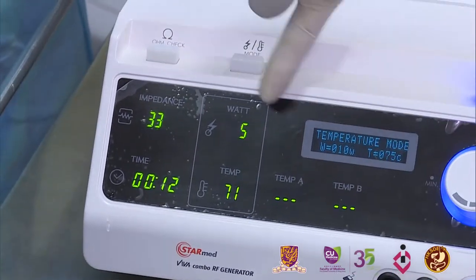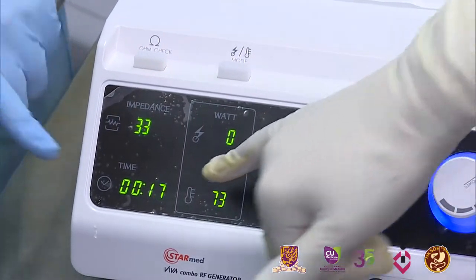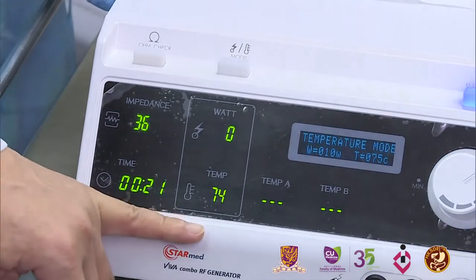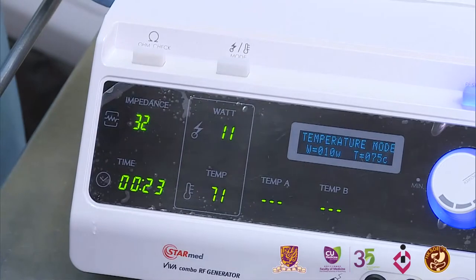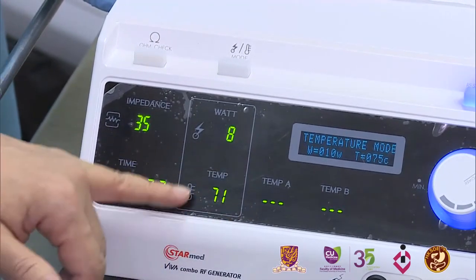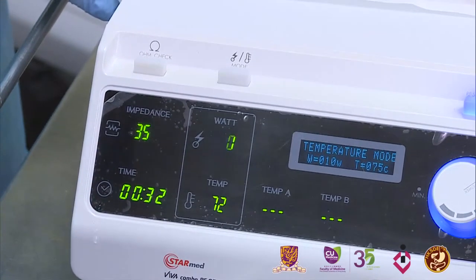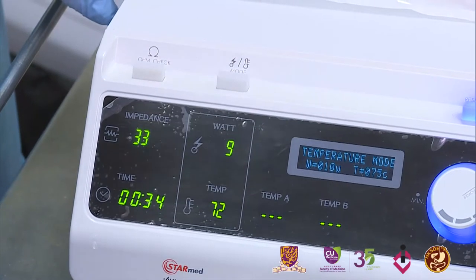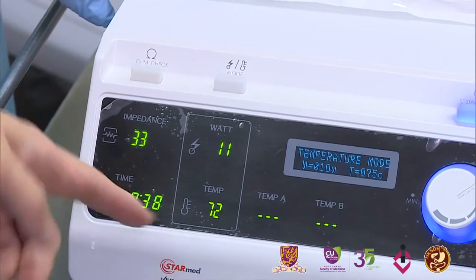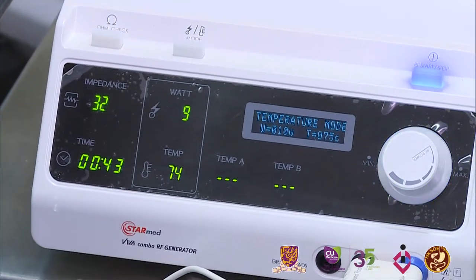But you see the wattage is fluctuating, which means wattage is not so important. The temperature should be maintained. And the timing is 2 minutes. So to create a consistent ablation, maintaining a certain temperature is very important, not just one time, but for a certain period of time. After many ex vivo experiments, we set these parameters: 2 minutes and 75 degree temperature.